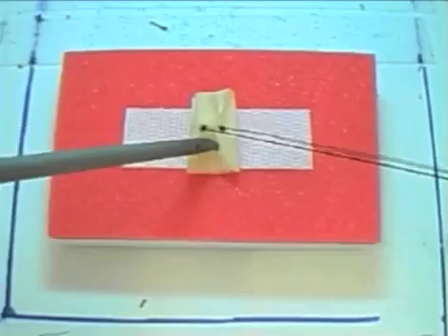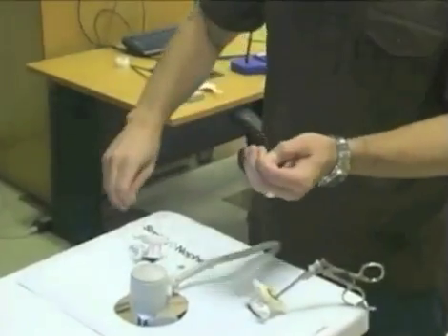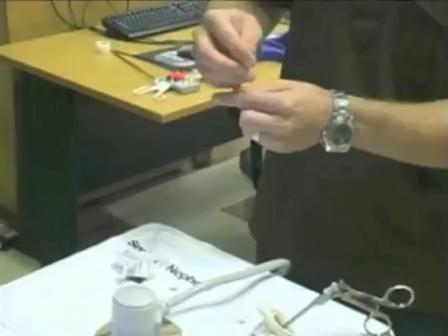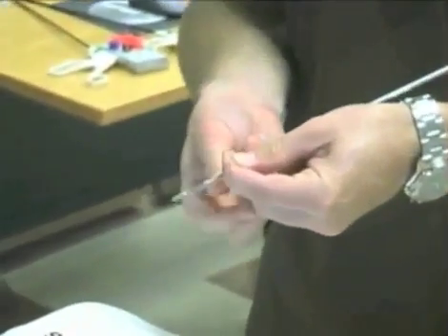Once the stitch is placed, pull it back outside of the trokar while stabilizing the penrose. The first throw of a square knot is thrown and the free end is threaded through the knot pusher as shown here.